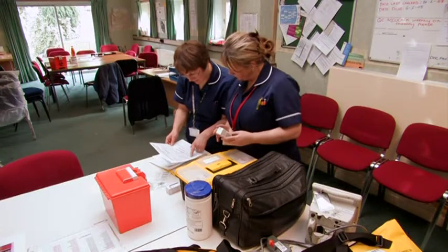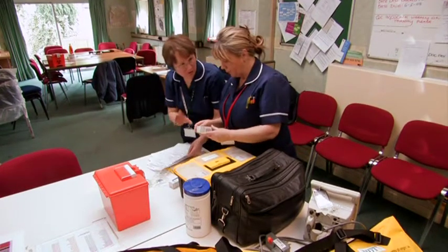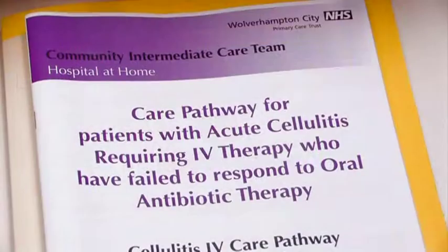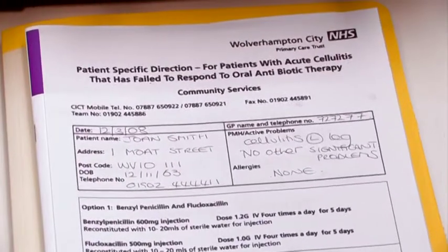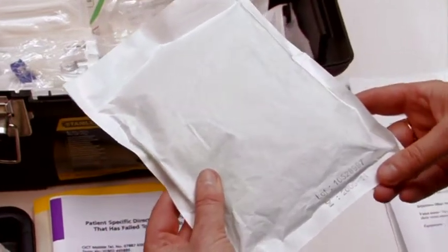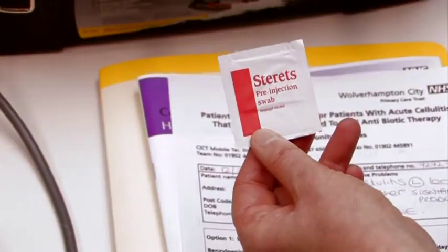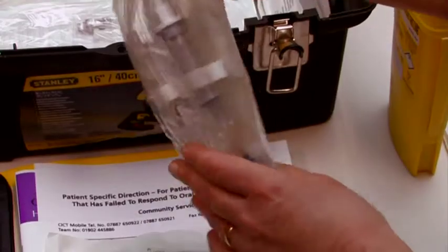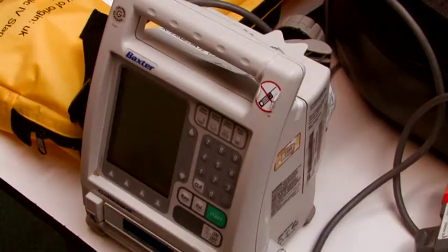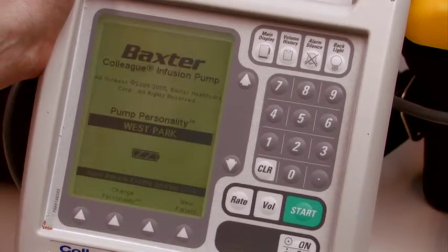It is essential for nurses to be appropriately prepared before commencing their visits, and the following checklist should be undertaken, including prescribed intravenous drugs and diluent, i.e. ampules of antibiotics, patient records, patient care pathways, letters of authority, sterile dressing towel, checking the date of expiry and that there's no rips or tears, sterile gloves, again checking date of expiry and that there's no rips or tears, tourniquets, sharps box, giving set, checking that it's sterile, the date of expiry and that there's no rips or tears, electronic pump, turning it on to check the circuit breaker if necessary. The Baxter pump would usually be kept on fully charged.